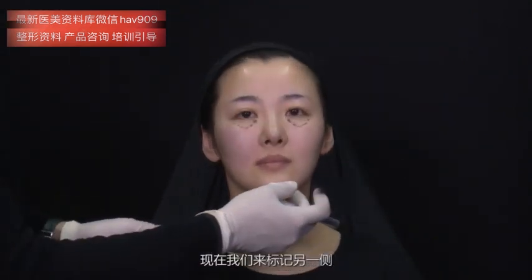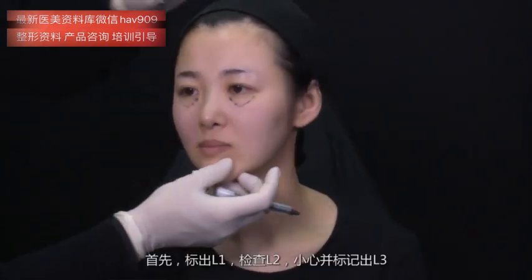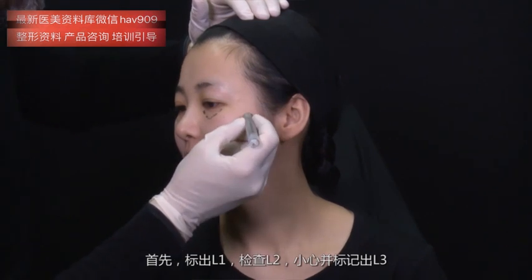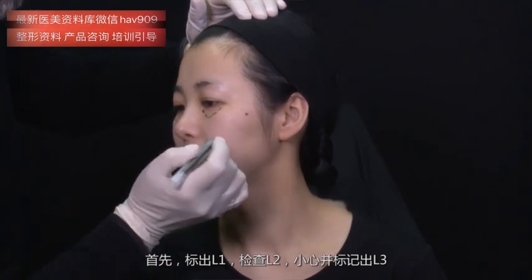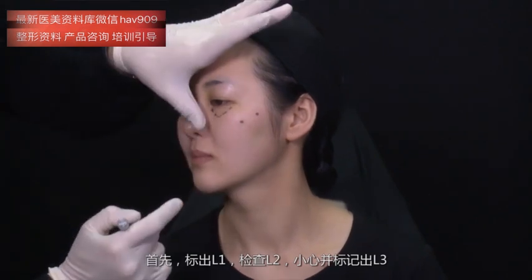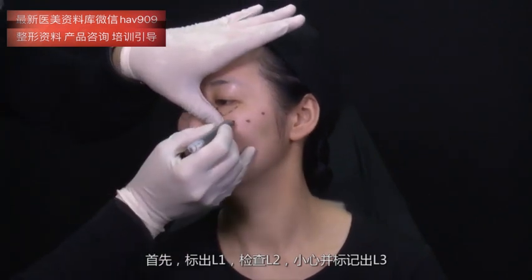Now let's mark the other side. So first, palpate L1, check L2, be careful with L3, and mark it.